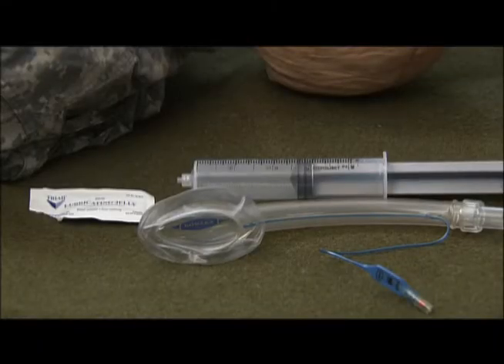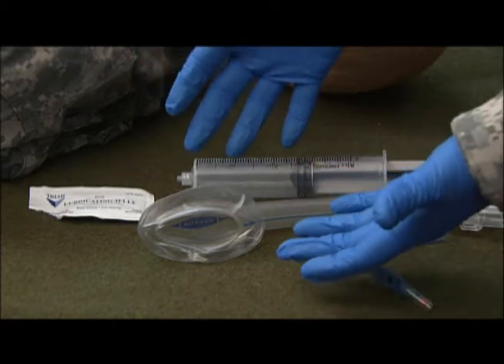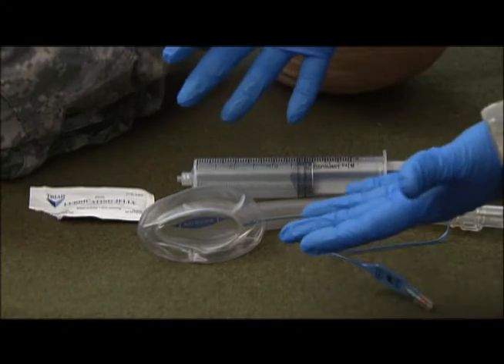I will now demonstrate the proper insertion technique for the laryngeal mask, or the LMA. First step, I want to take proper body substance isolation precautions.